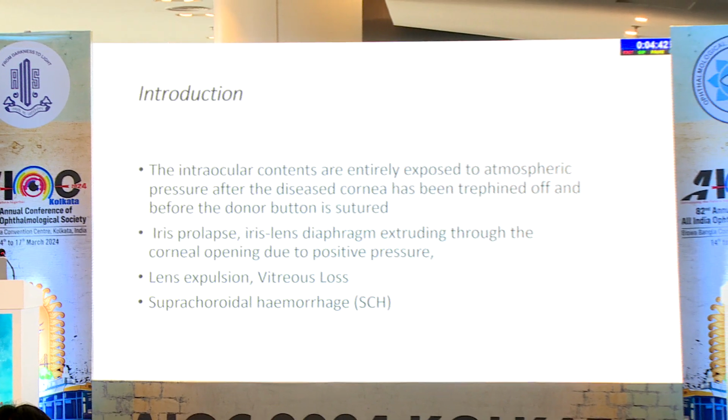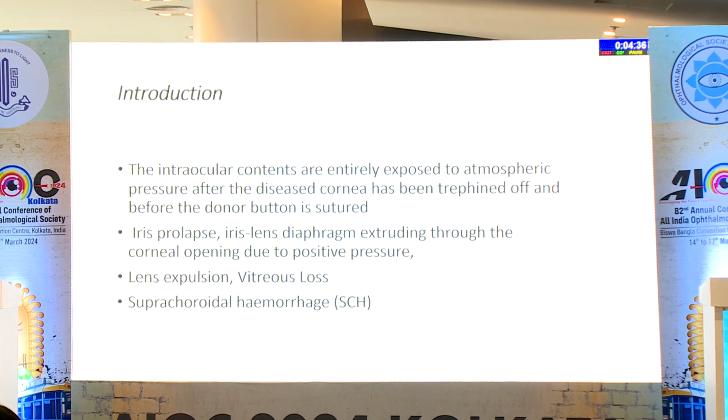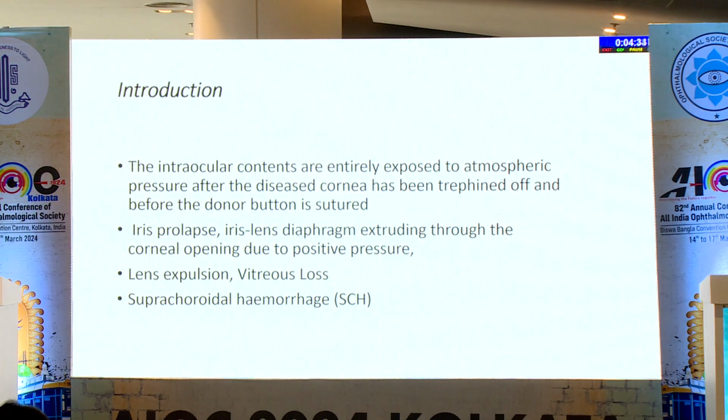As a cornea surgeon, despite years of experience, whenever we do a TPK procedure in cases of complicated pre-op indications, after taking out the cataract we may encounter vitreous push, sometimes iris push, and the most dreadful condition is expulsive hemorrhage. Whatever we try, we give the patient pre-op mannitol, it may still happen sometimes, and it is a very dreadful situation for a cornea surgeon.